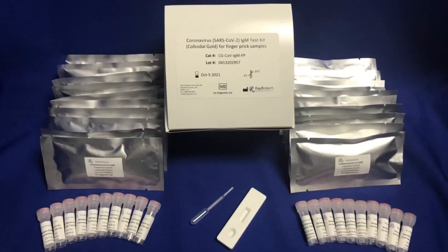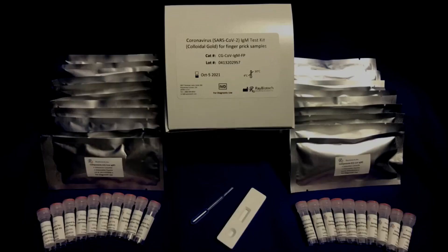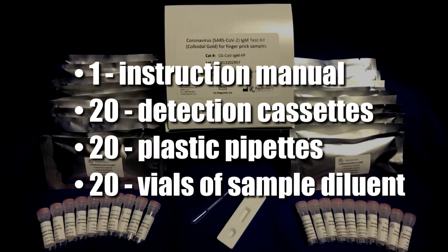Each rapid test kit will arrive in a box containing the materials to perform 20 individual tests. This includes one instruction manual, 20 detection cassettes, 20 plastic pipettes, and 20 vials of sample diluent.